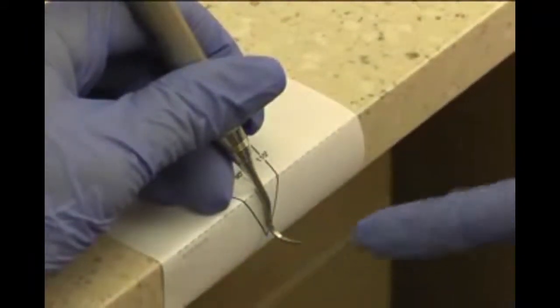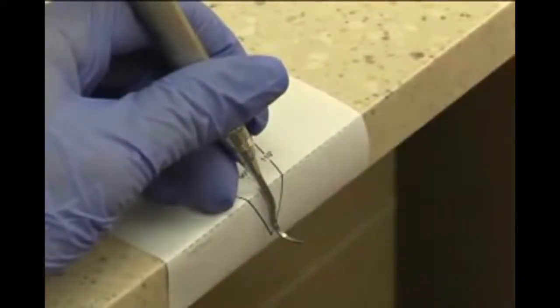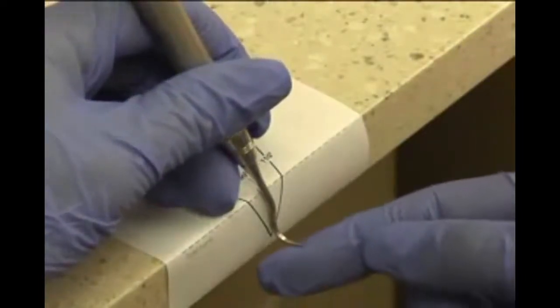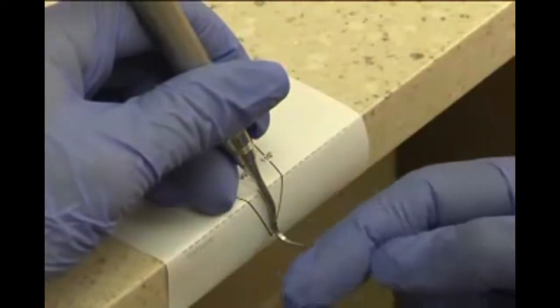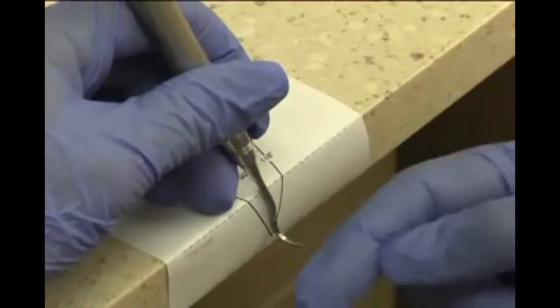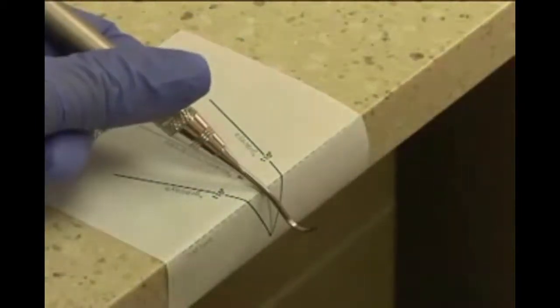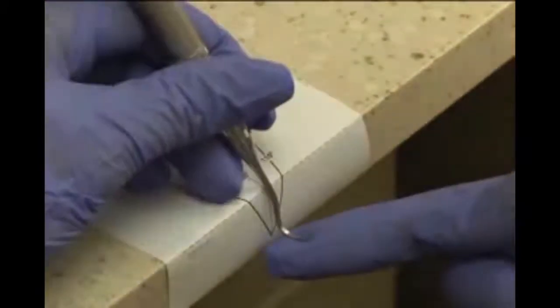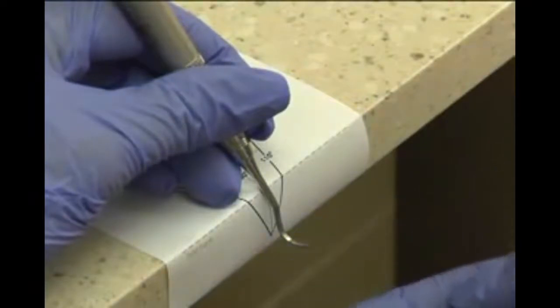And I usually try to keep the blade right at the V of the guide. Now, if you don't have a guide, you can make up your own guide. It's easy to do. So you just have your terminal shank at the 90. The toe is toward me. And the reason why I say that is because some people tend to move the instrument up like this, and it's pointing up. So you don't want to do that. You want to keep it towards you. And then the face is automatically parallel to the ground as well.